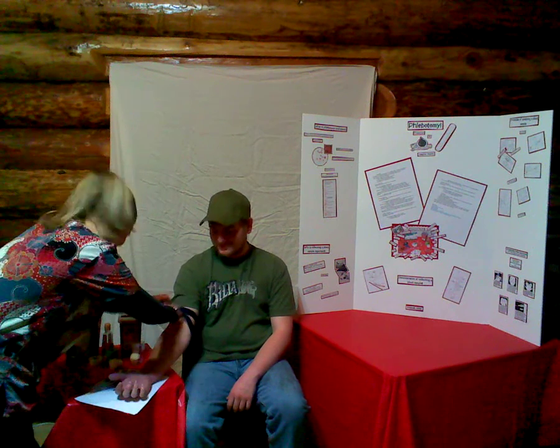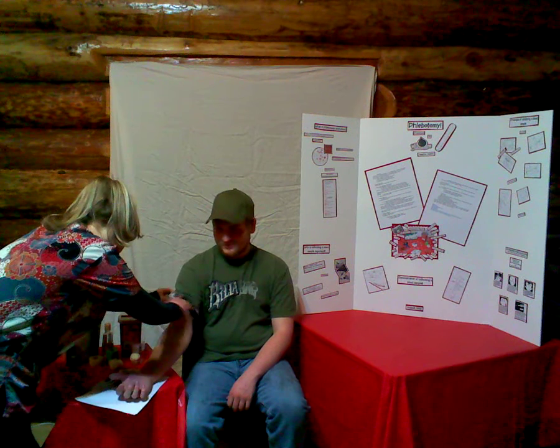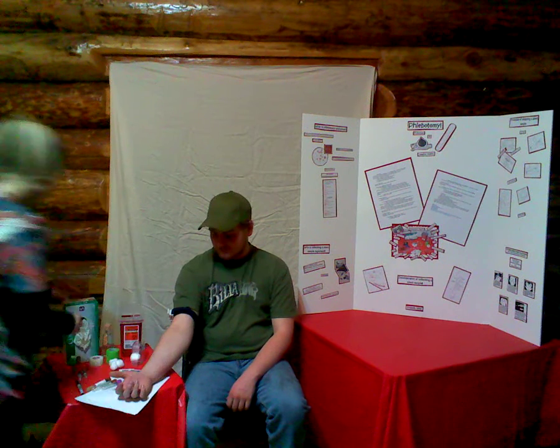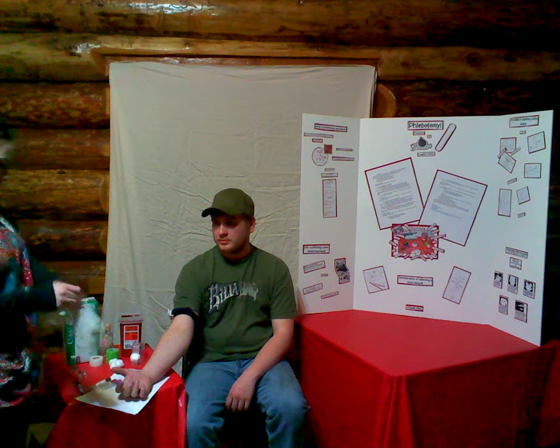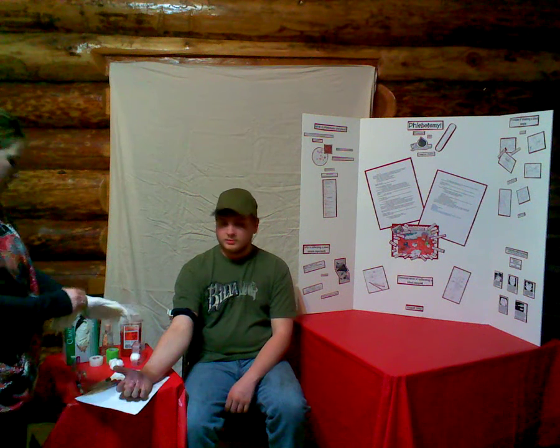There's a good one. So I found a good vein to use. I'll now apply some gloves.